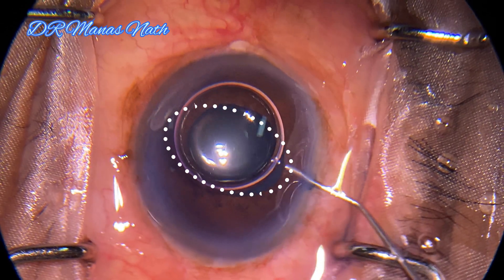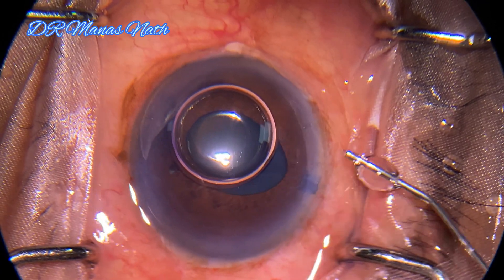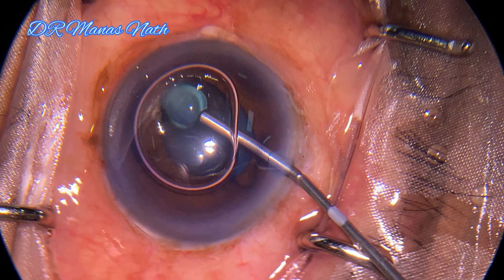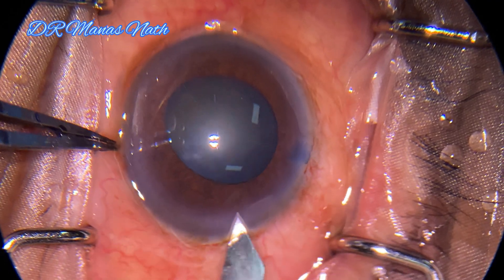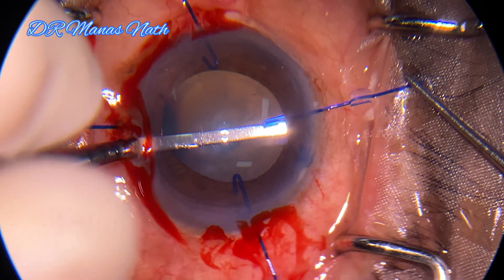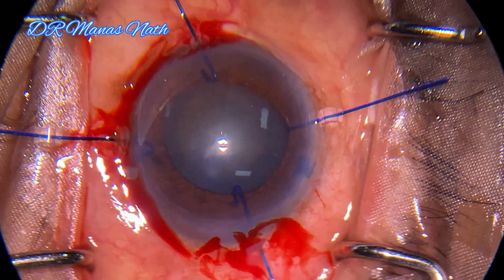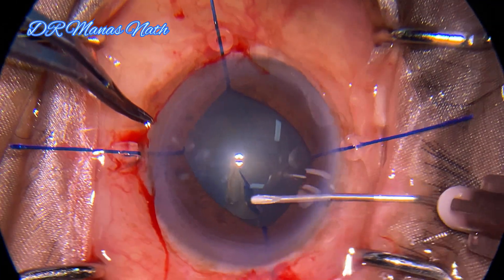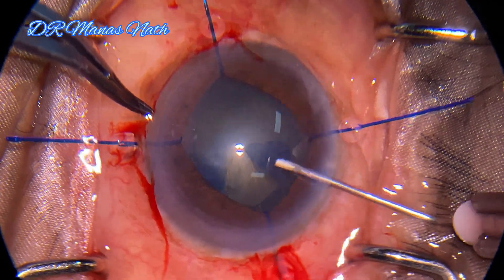This shows that the pupil is quite floppy and there's a high chance that during surgery it's going to constrict, so it's better to use pupil-expanding devices. I usually prefer iris hooks here, though one can always use other devices as well. The main aim is just to prevent the iris from coming into the operating field. You will see that I have not over-stretched the pupil, and at the end the pupil is near normal.